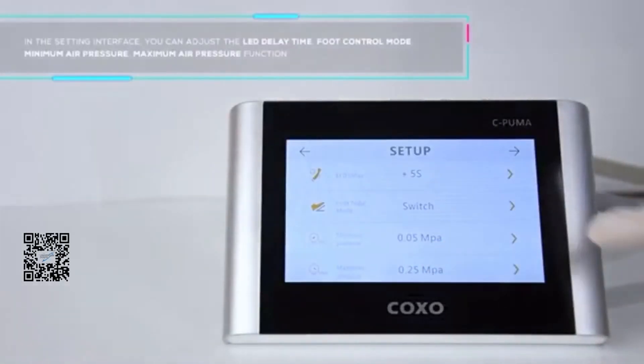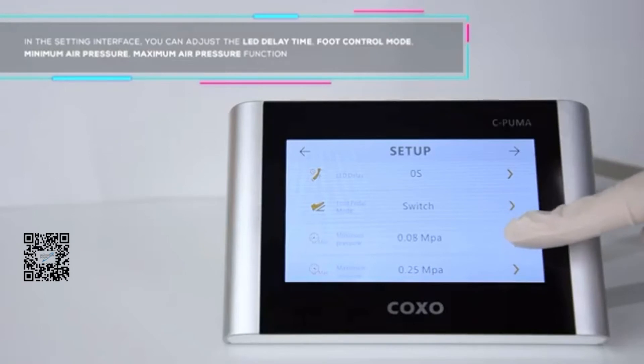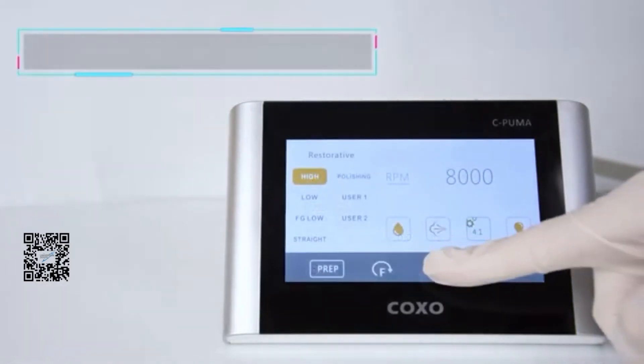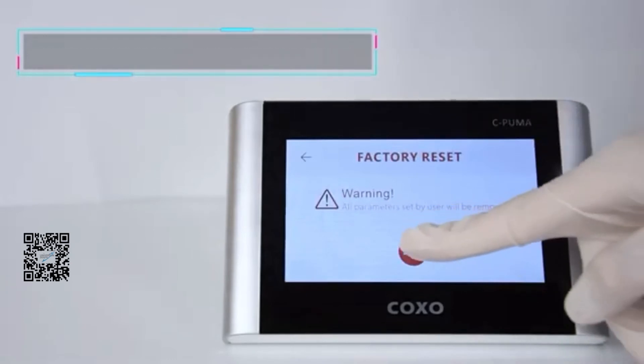In the setting interface, you can adjust the LED delay time, foot control mode, minimum air pressure, and maximum air pressure function. You can also restore factory settings in electric motor mode or in endomotor mode.